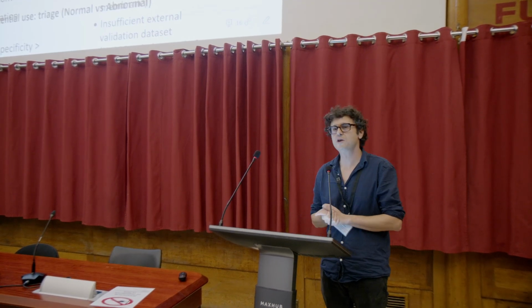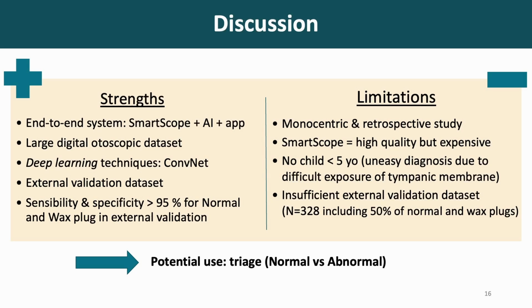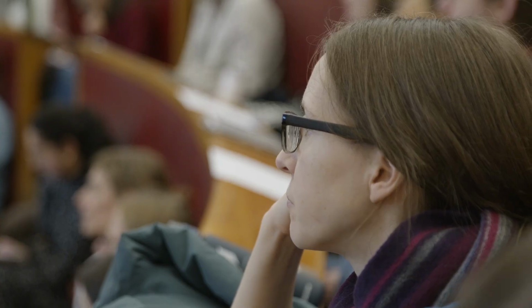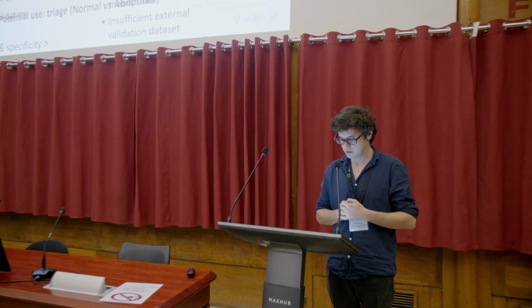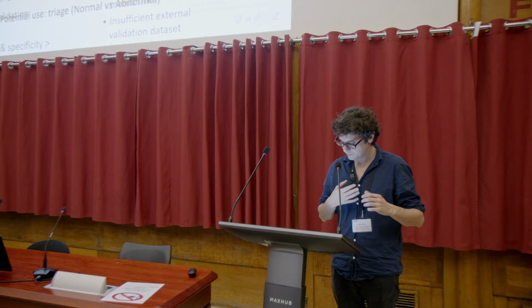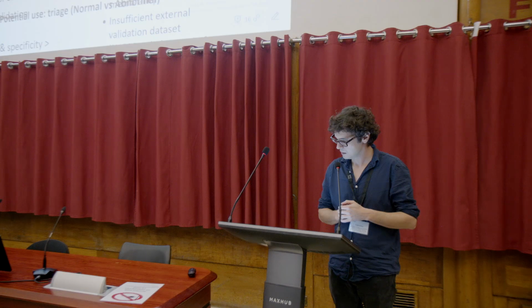So the nice thing in this project is that we have an end-to-end diagnostic system. You have a digital otoscope, you have a model, and you have a smartphone app. So this is readily available. I use it sometimes. We have leveraged a very large digital otoscopic data set, and we have used state-of-the-art deep learning techniques with convolutional networks. We had an external validation data set, which is quite rare in the field.